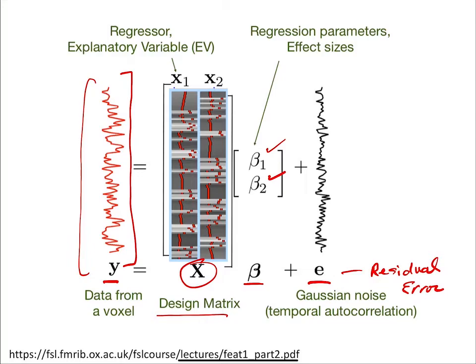All right, so that's all the general linear model is. Today we're going to go over the simple form of that. On Wednesday we'll make it slightly more complicated and add nuisance regressors and confounds and other things. Today we're just going to focus on what happens if you just have the brain response.